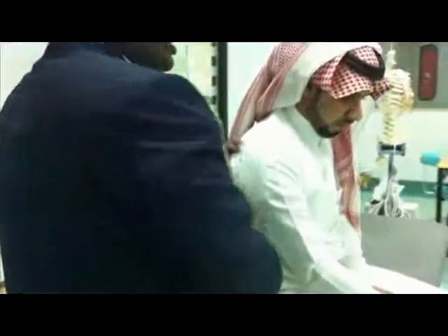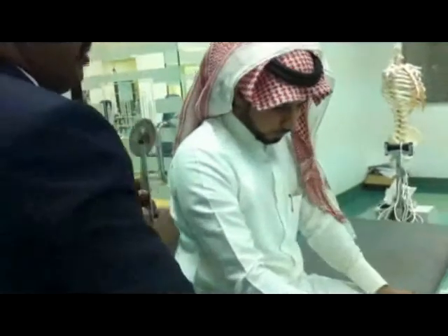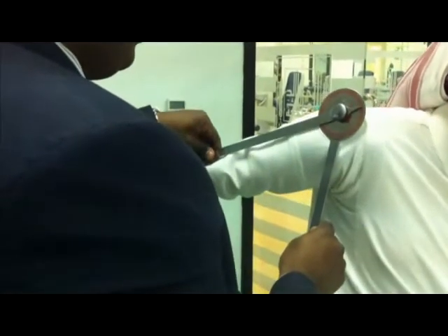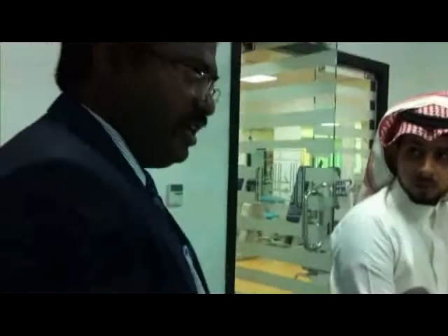Extension. Again, same position: patient position sitting, therapist beside the patient, fulcrum at the acromion process, mobile arm to the humerus, stationary arm at the mid-axillary line. You have to move the arm backwards. I started at 0 and went up to 70 — so extension is 0 to 70 degrees. But normally it may go up to 50 degrees; 0 to 50 or 70 is normal. For flexion, 0 to 180 degrees.